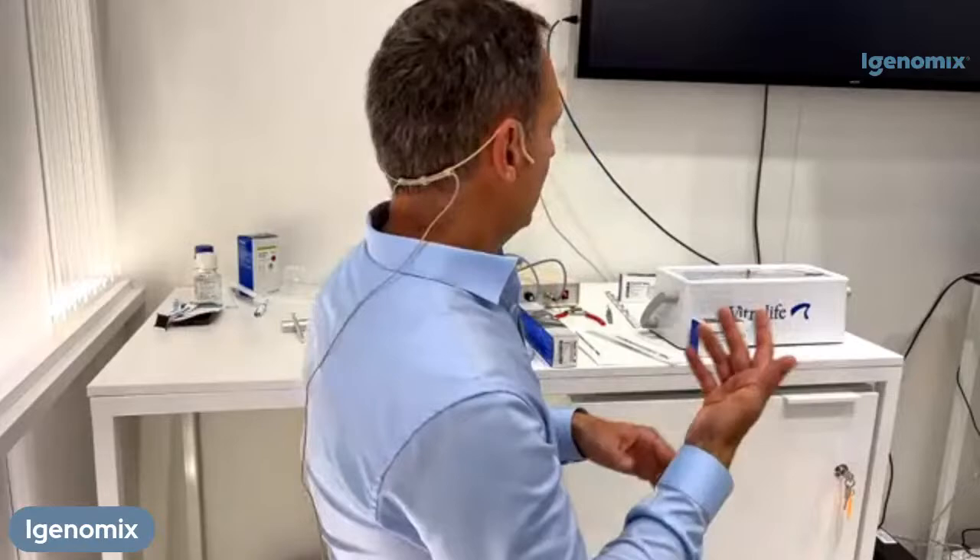We have a very good e-learning program that you can access free of charge on our website. We go through all the steps very carefully, including underfilling and overfilling of the hole. We want to make sure the hole is completely filled — if everybody does it exactly the same, you have better reproducibility and much better results going forward.